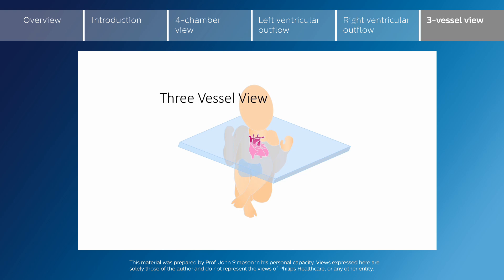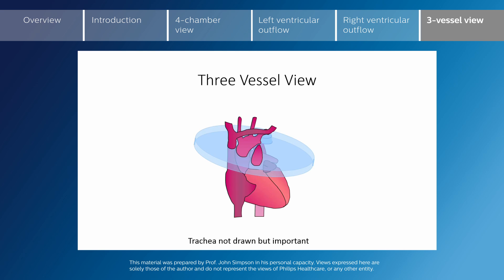Moving to the most superior view is the so-called three vessel view. We have moved above the level of the right ventricular outflow tract and are now cutting these vessels in transverse section: the pulmonary artery and duct, the transverse aortic arch, and the superior vena cava. The three vessel view shows us the V of the pulmonary artery and duct, the transverse aortic arch, and the superior vena cava in short axis.